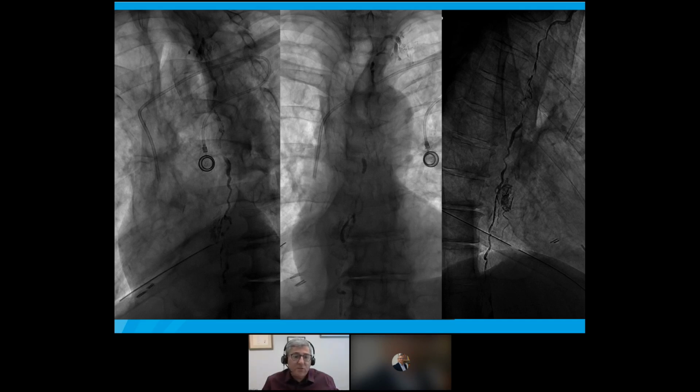Once we have opacified the whole lymphatic system from the groin up to the thoracic duct, then you can make your diagnosis of most of the cases of chylous leak. Here in this case, for instance, this was a patient after a lobectomy for a malignant lung cancer at the right side.